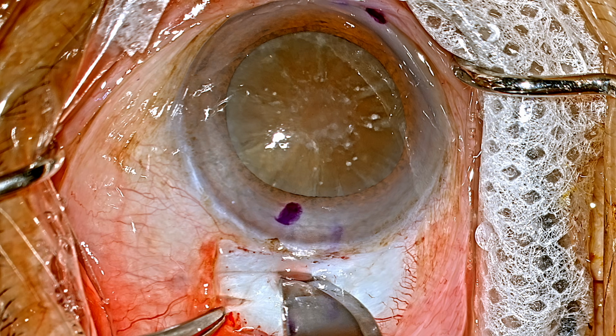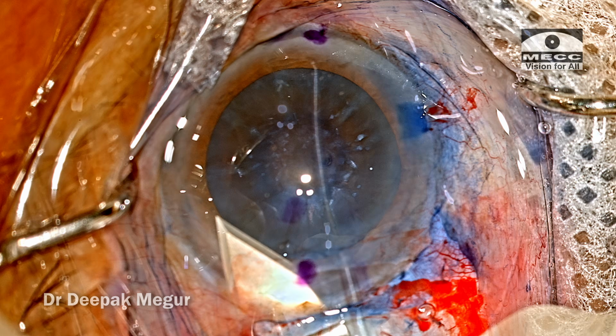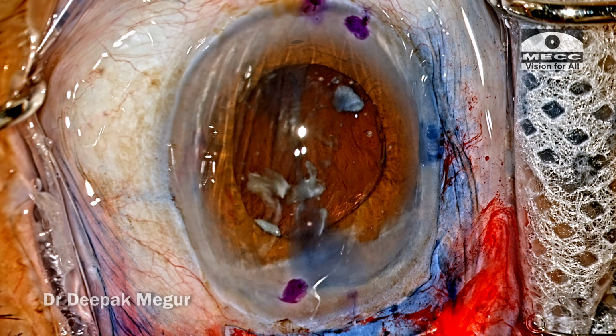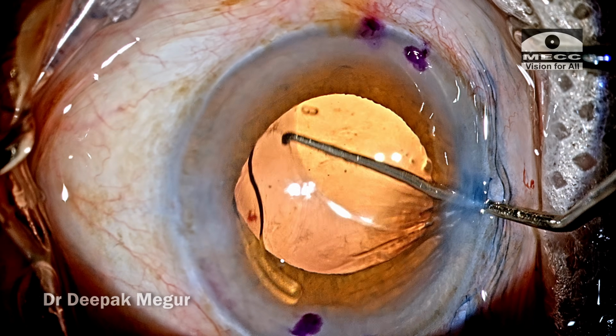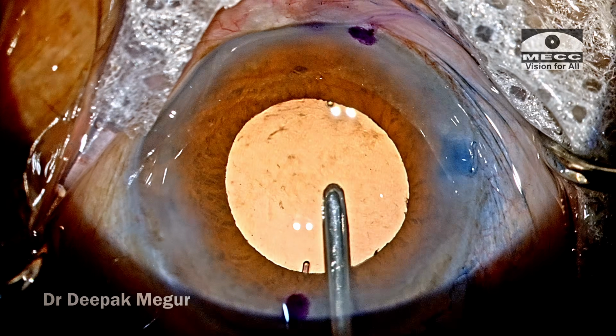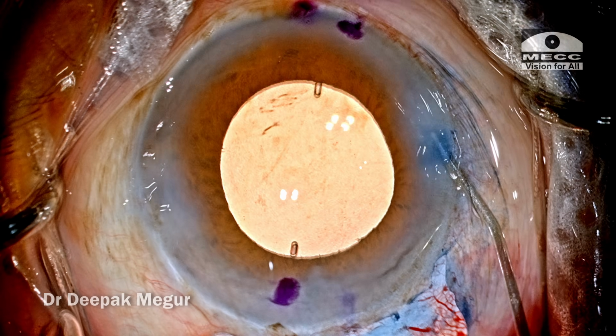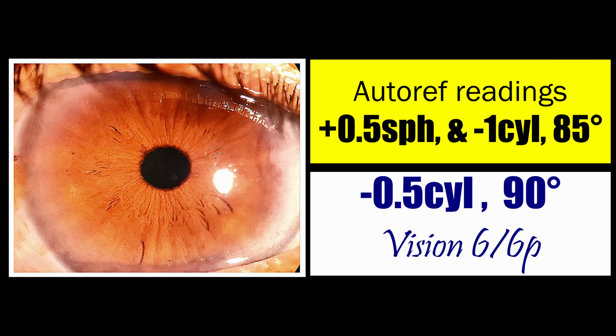To summarize, this case just highlights that if your wound construction in SICS is appropriate, you can get a predictable surgically induced astigmatism, and then you can go ahead and plan with a toric lens as well. So in such complex cases, you can still give the patient the best refractive outcomes even with manual small incision cataract surgery, without compromising any of the safety measures.